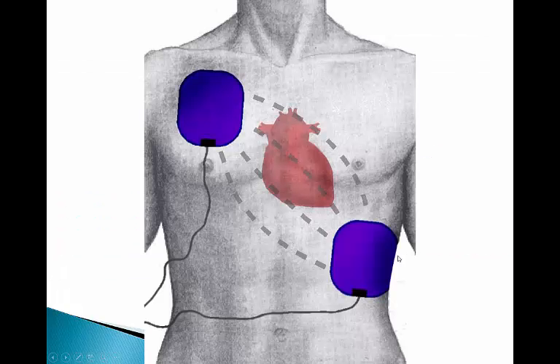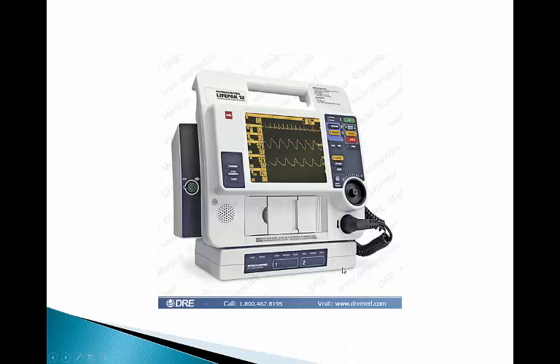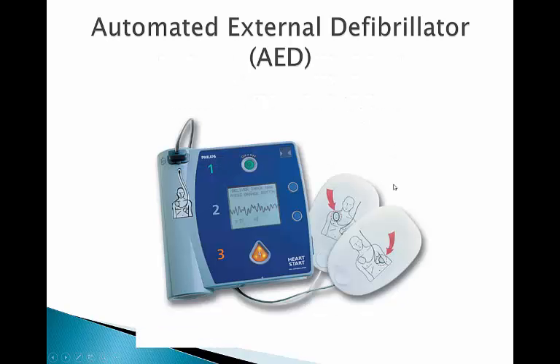All right, just a picture of your shock pads, your defibrillation pads. Here's a picture of one type of monitor that we can use. There's a shock button. Somewhere around there's probably a sync button too, as far as syncing for cardioversion. The AED, you know about an AED from CPR class, so I'm not going to go over that.